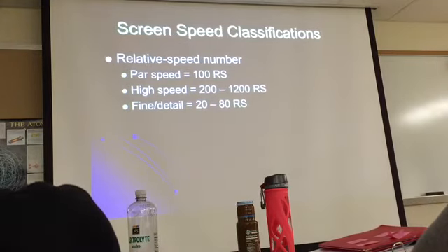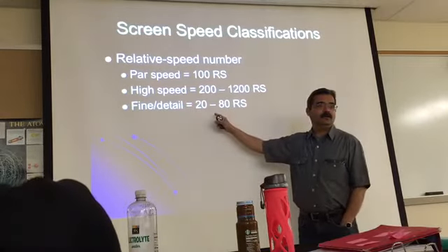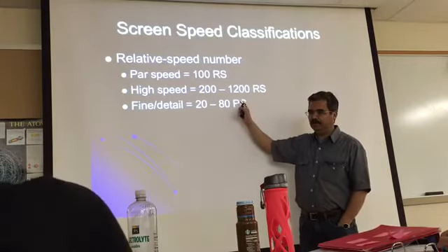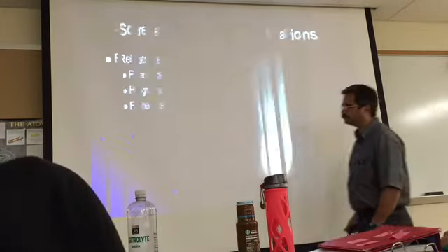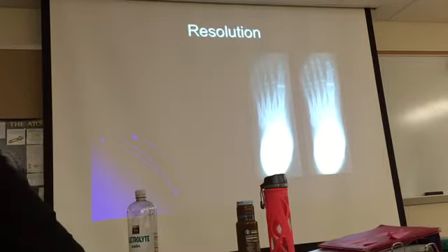And then you also had the very fine detail speeds, even lower than the par speed, as low as 20. The price you pay with speeds like this was what? Patient dose. Dose goes up. Great resolution, but it's not convenient for the patient.